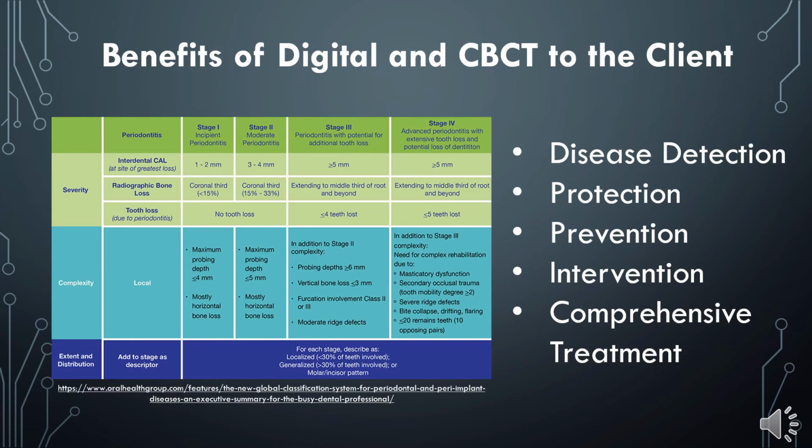Benefits of diagnostic imaging include detection of diseases and conditions that can't be identified clinically, confirmation of lesions and foreign objects, and evaluation of growth and development. This assists in accurate diagnosis, prevention of further disease, and an appropriate treatment plan.